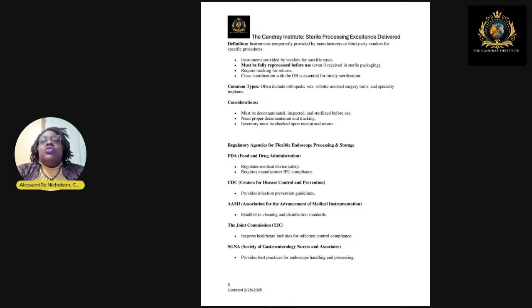This one is over gastroenterology, and it's nurses and associates that are working in the gastro field. You guys will often notice, if you're just driving down the highway, you will see the little colonoscopy sign up by the road, right? A lot of flexible scope procedures get done in offsites or surgical centers, not necessarily within the hospital system itself.